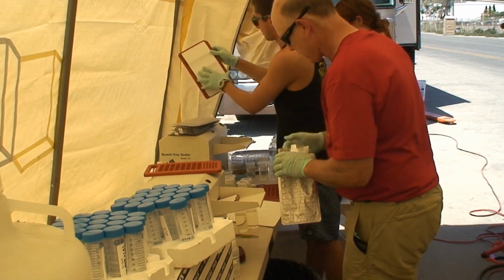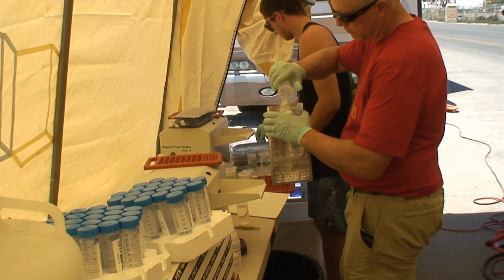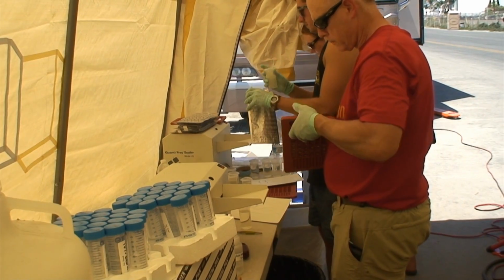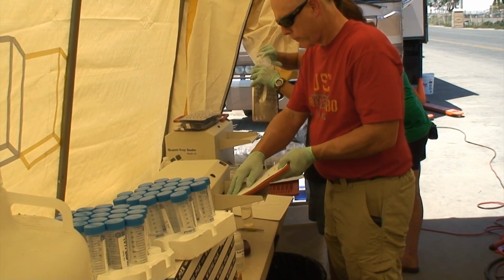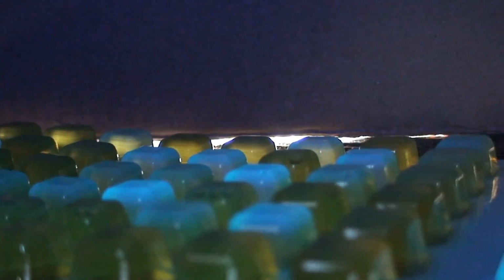The second culture method we employed was called Colilert, and that targets E. coli. For that, we take a known volume of sample water and pour it into a vial that has a liquid growth media in it. You mix that up and pour it into something called a Quanti-Tray and seal that. You put it into the incubator, and 18 hours later you count basically the amount of change in color and the amount of fluorescence under UV light. With that information, you're able to determine what the concentration of E. coli was at that site at that time.